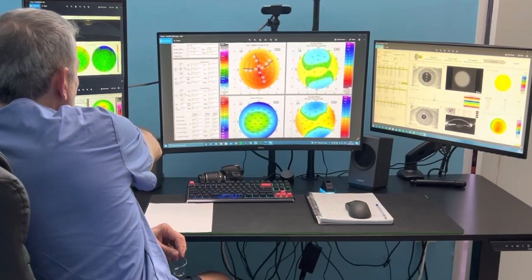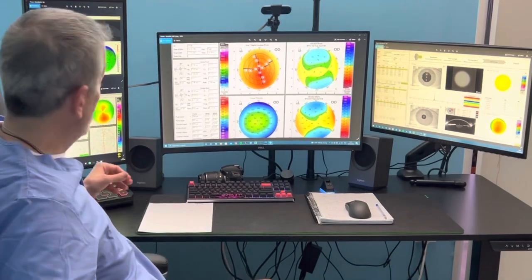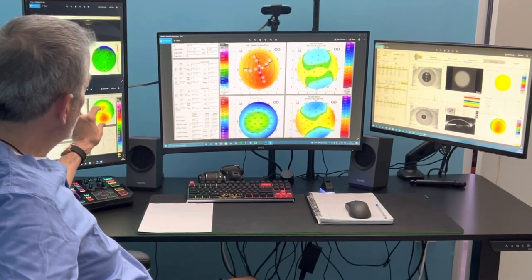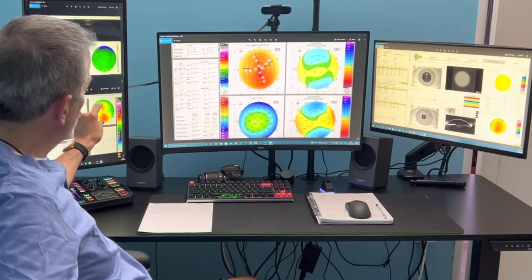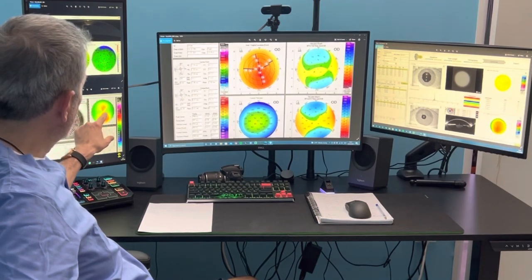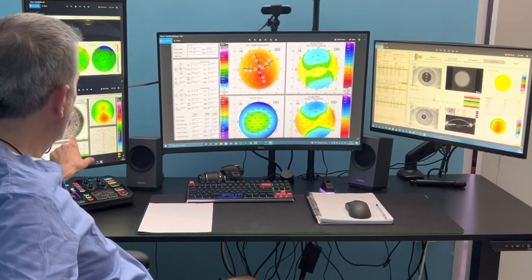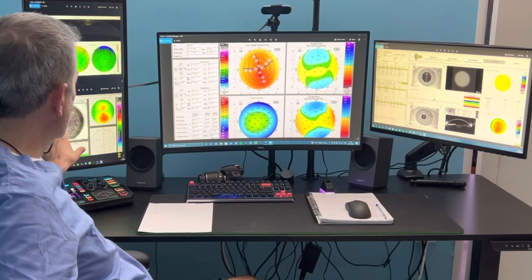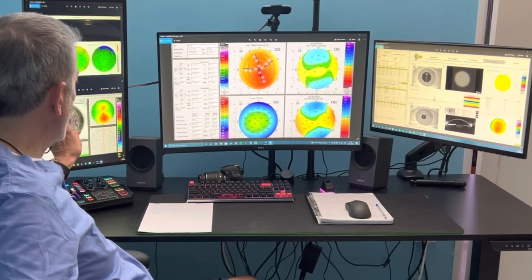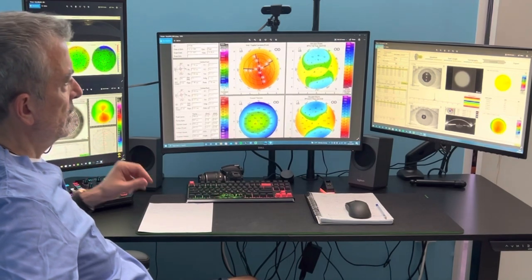Going to the Placido disc topography — I don't know if you have a clearer shot from there — we have a little bit of truncation and there's a little bit of asymmetry. These are the Placido rings, which give us a clear picture that these are real data. There's little angle kappa.